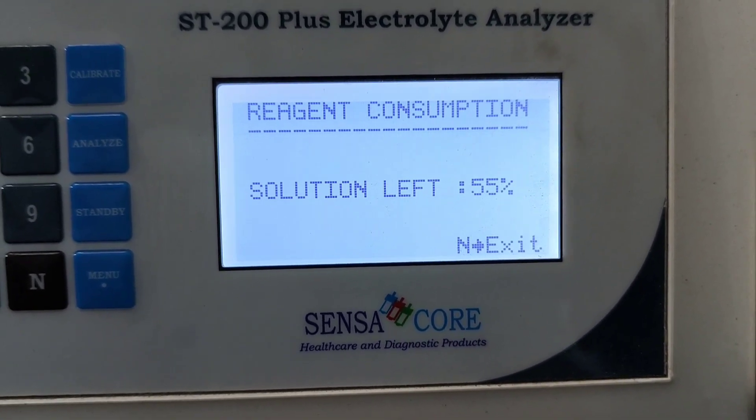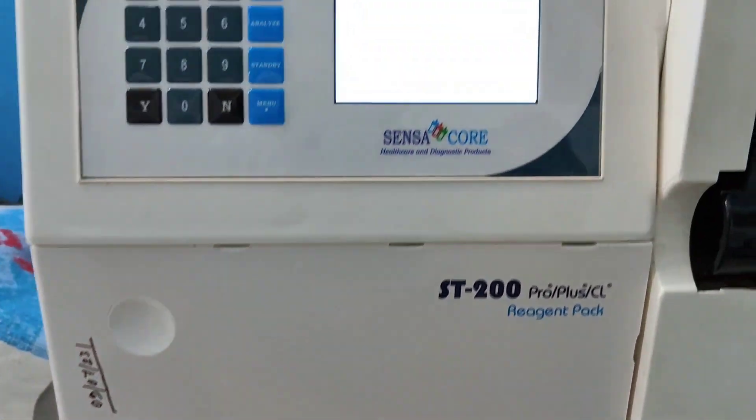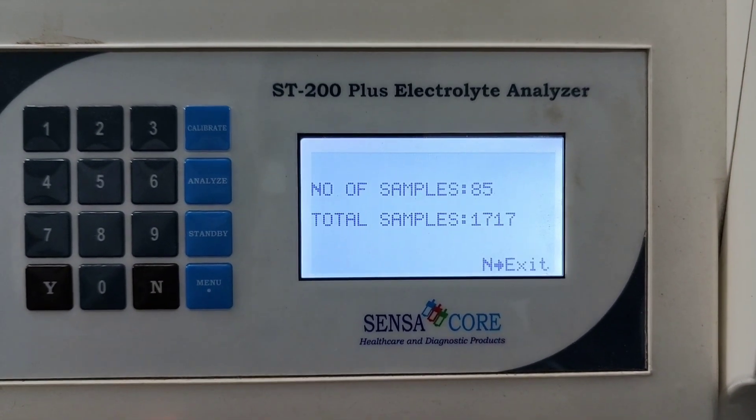That means 45 percent of solution from this reagent pack is already used. Now, N for exit. Total sample count, number of samples — it's showing.